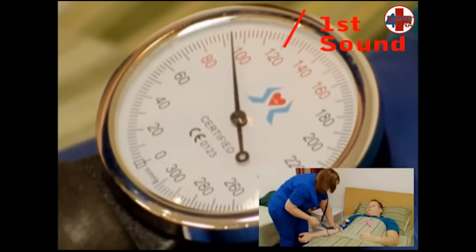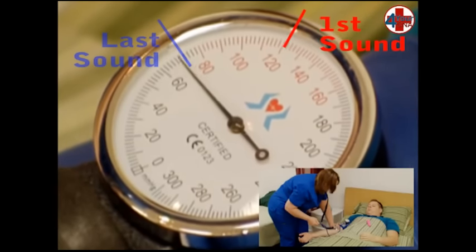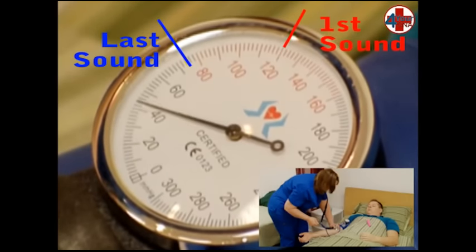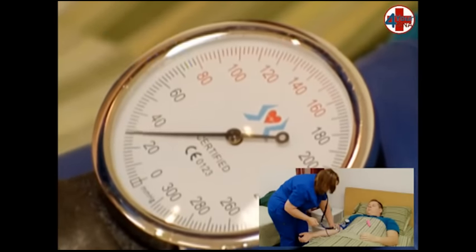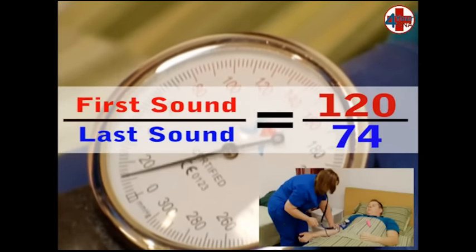Listen for the first and last Korotkoff sounds. The needle may bounce with each heartbeat, but we record what we hear, not what we see. Keep this slow controlled rate all the way to zero. In this demonstration, the first Korotkoff sound was heard at 120 and the last at 74.